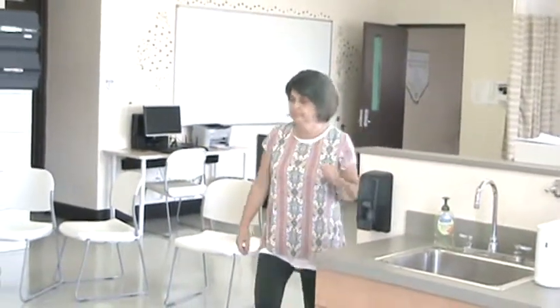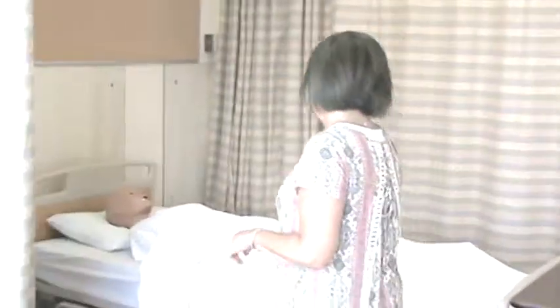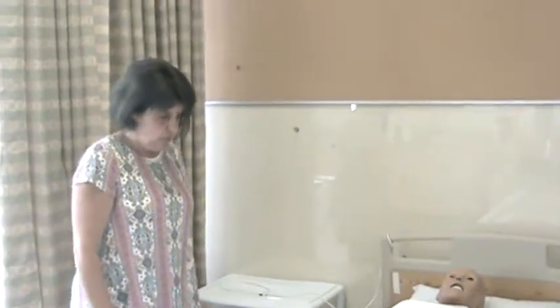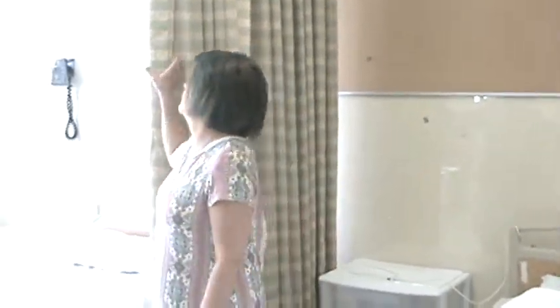Empty the contents of a urinary drainage bag and measure and record the results on the intake output form. Good morning Mrs. Jones, my name is Sharon and I'm your N.A. for today. I'm here to empty your urinary drainage bag — is now a good time? I'm going to go gather my supplies, wash my hands, and I'll be right back. I'll pull this curtain shut to provide for your privacy.